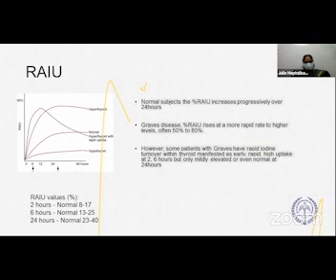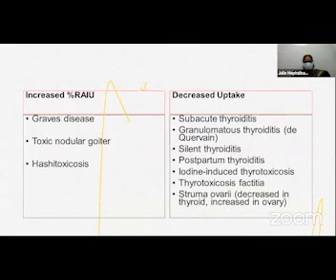So this is the normal range. At 2 hours, it's 8 to 17%, 6 hours, 13 to 25%, 24 hours, it is 23 to 40%. This is what we use in our institution.